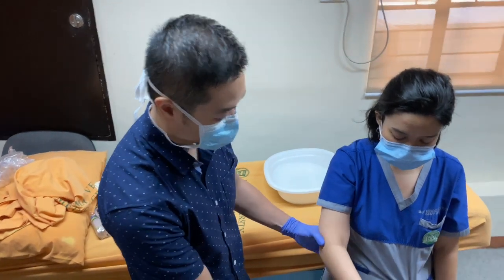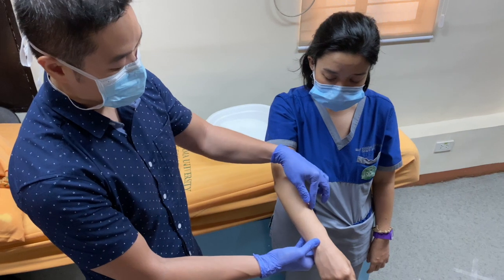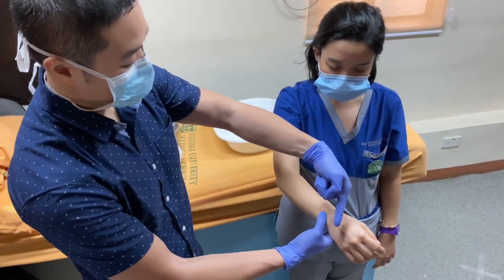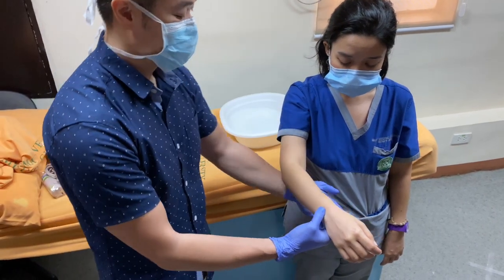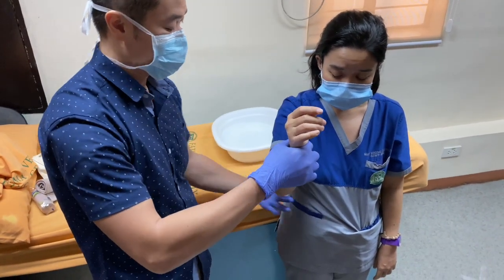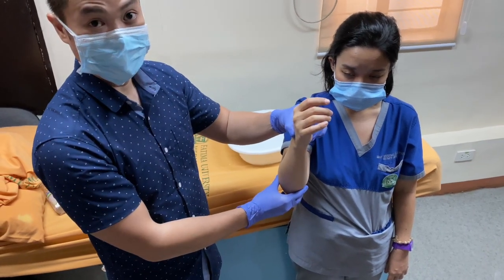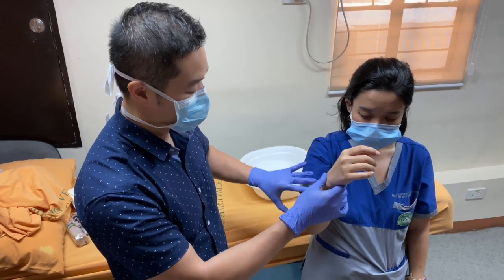For radius and ulna fractures, you have an injury to the radius and ulna. We will be applying a U-mold. The U-mold goes from the posterior aspect, then going to the palmar aspect — from dorsal going to palmar. That's your U. In this way, you can immobilize your radius and ulna without being too extensive in immobilizing the upper arm.